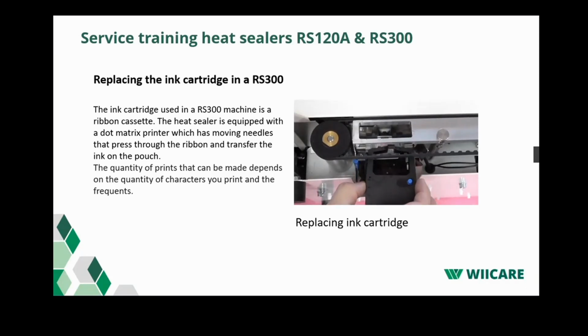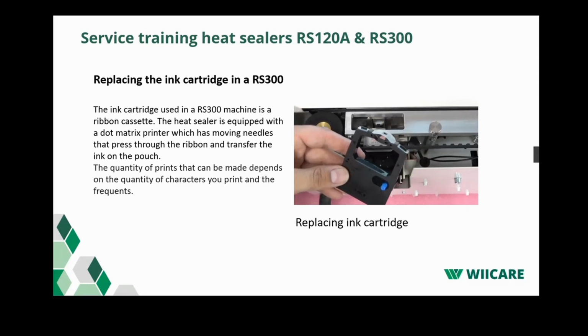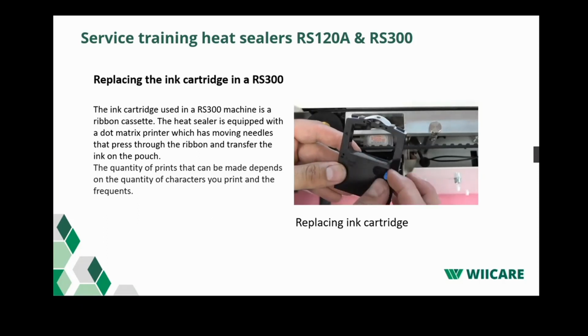Now you can remove the old cassette and insert a new one. When unpacking the new ink ribbon cassette, do not remove the little plastic guide on top of the cassette, as this has a guiding feature for the ribbon. Tighten the ribbon of the new cassette in the direction indicated by turning the blue knob on the front of the cassette.